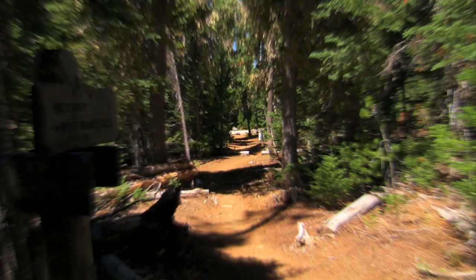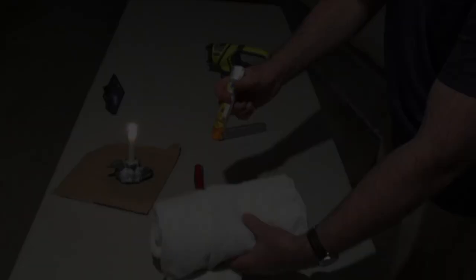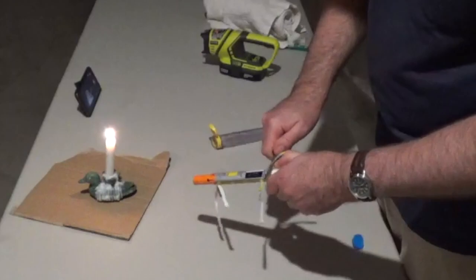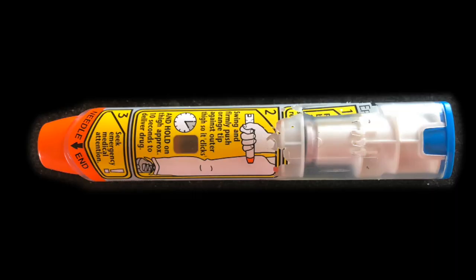But what do you do if you're in the woods and you're hours away from help? There is a way to get extra epinephrine out of an auto-injector with minimal supplies. Give your patient shot number one with the auto-injector. While that starts working, whittle off the label on the outside of the auto-injector so you can see the inner mechanism a little bit better. You're gonna be focusing away from the needle end — that's the orange tip on this auto-injector. The area you're aiming for is right about here where you can see through most of the pen and there's just a little central plastic core.